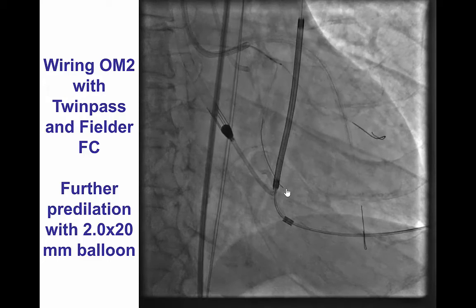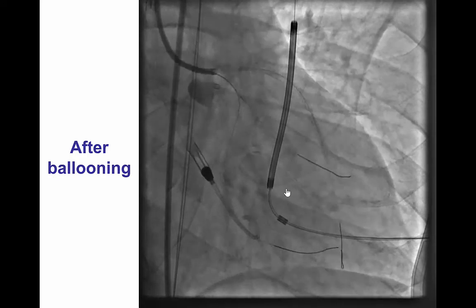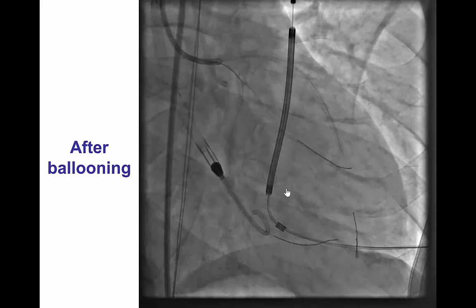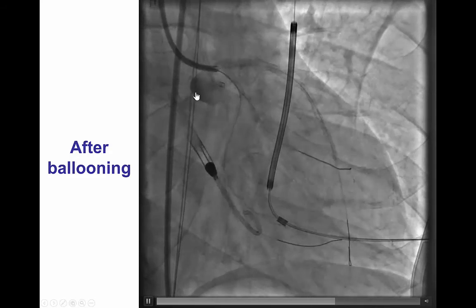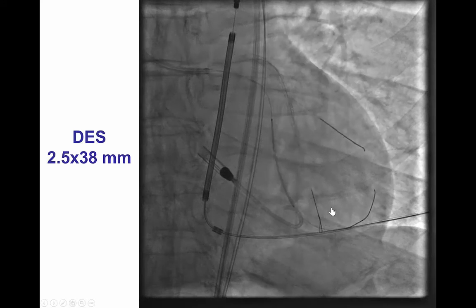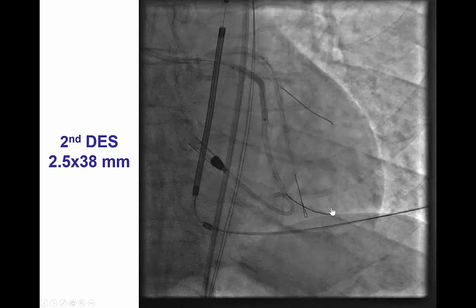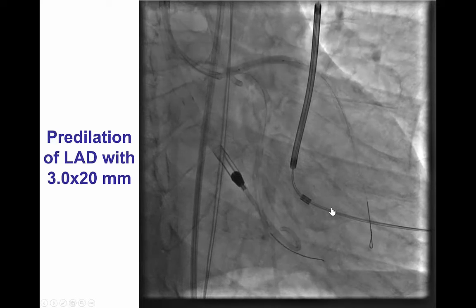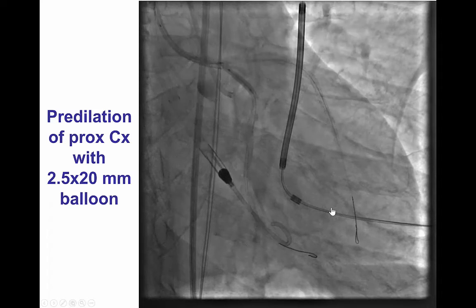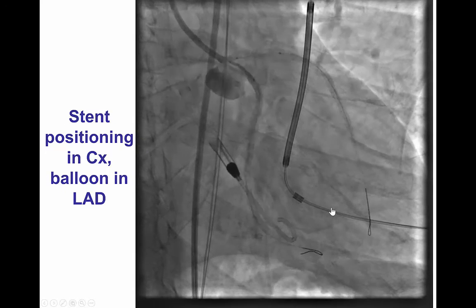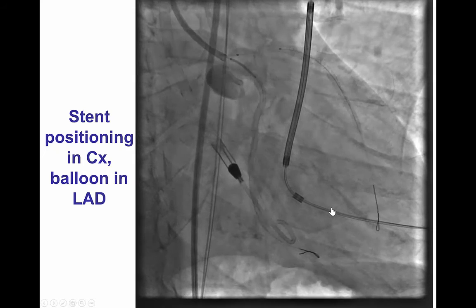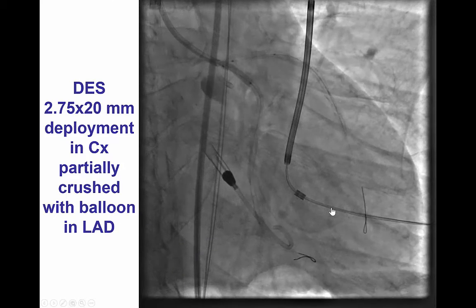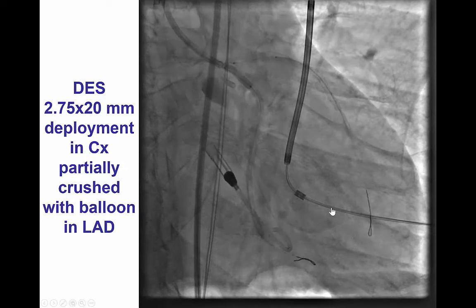Both vessels were predilated with a 2.0 mm balloon. After ballooning, there is restoration of antegrade TIMI flow, although there is still some dissection into the proximal circumflex and flow into the LAD. We placed a stent into the distal circumflex and a second stent overlapping proximally covering the proximal circumflex. Then we predilated the LAD and the circumflex, and placed a stent in the proximal circumflex with a balloon in the LAD for essentially a mini crush. We deployed the stent into the circumflex — a 2.75 by 20 mm stent — that was then crushed with the LAD balloon.